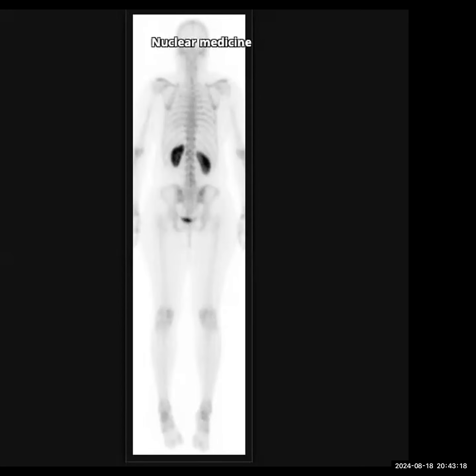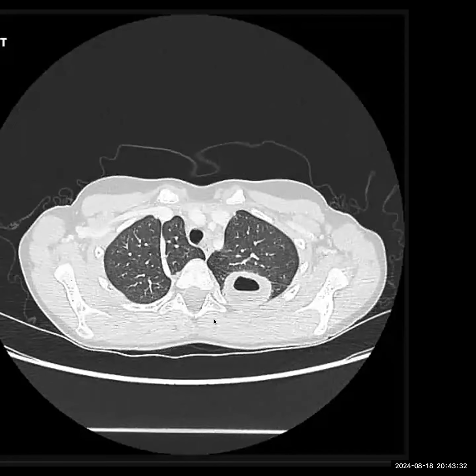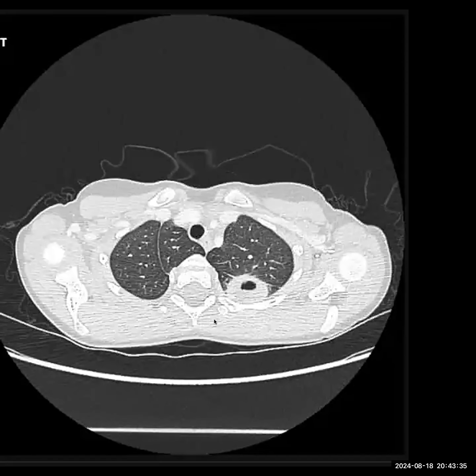Having said that, something which I felt was you were repeating a few things more and more often. The first case that I showed you, I think, was this, right? When you were describing the X-ray, I think you said I would ask for prior history, and again towards the end you again said I would ask for prior history. You don't have to repeat things. When you know that the case is very straightforward, you're seeing a cavitating lesion, you have to just wind it up as soon as possible. You know it's an opening case and it's a very easy case, so do not waste time on that. I think you roughly spend 4 minutes on that, which is not essentially required.